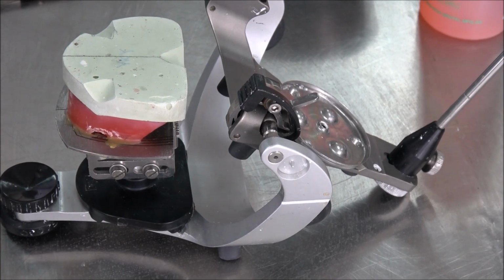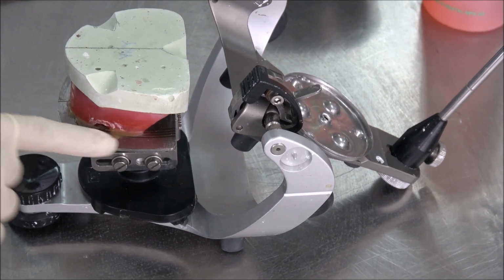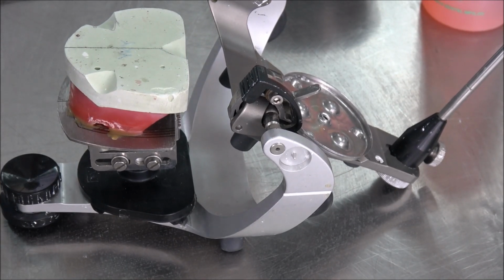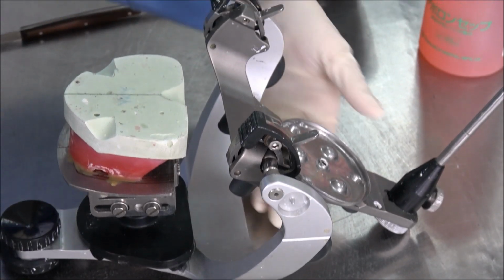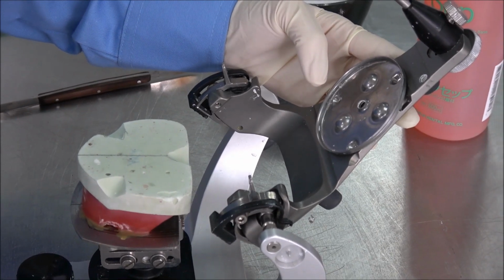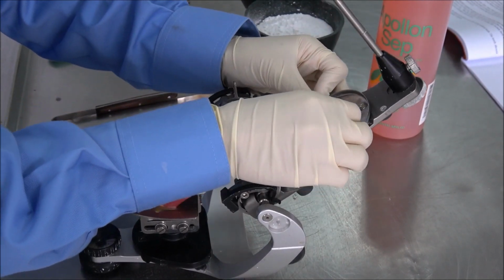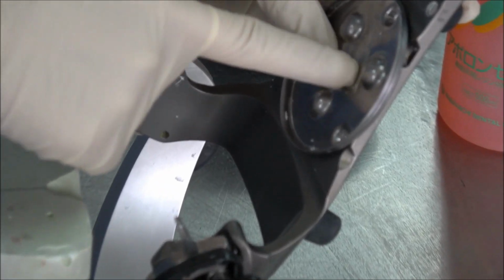So before we mount, we make sure our midline and both sides are balanced, and make sure the occlusal rim really sits on the occlusal table. So if everything is ready, we start now. We are using cellophane tape on our mounting plate, to make it easier to demount afterwards. Okay, we place it to cover the hole here. Okay.